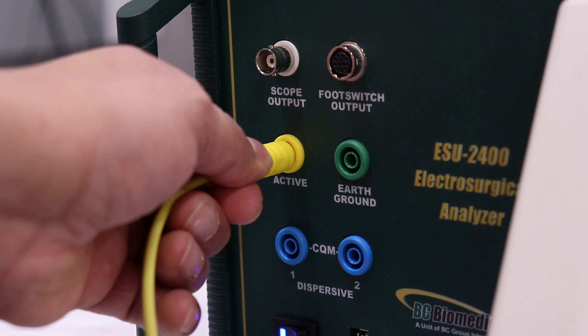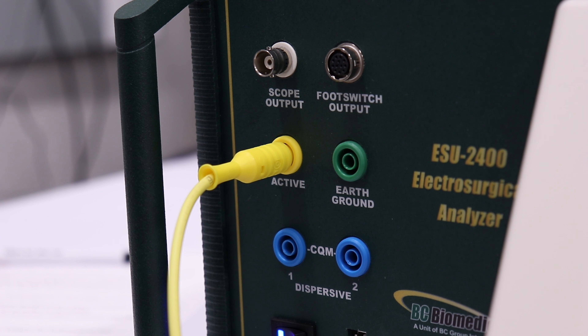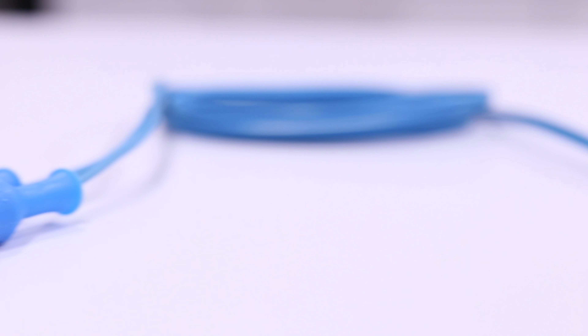Connect the opposite end of the active test lead to the active receptacle on the analyzer. For monopolar output testing, we will use the blue neutral electrode. Connect the single-ended connector to the PSS receptacle on the GI-4000. Connect the opposite split ends of the test lead to the dispersive 1 and 2 receptacles on the analyzer. Note the change of the PSS indicator light from red to amber on the GI-4000. Press the isolated generator type button to configure the analyzer for isolated generator measurements.